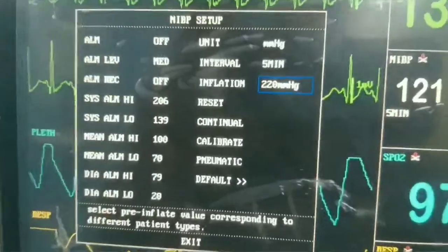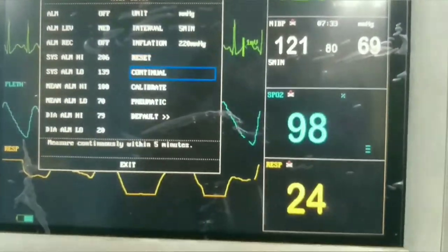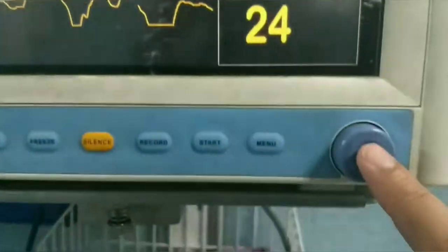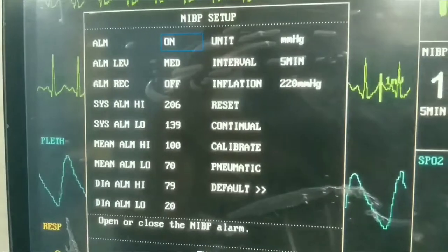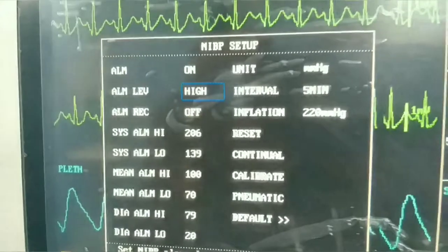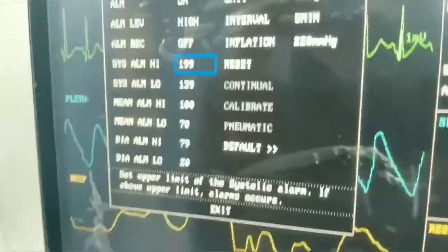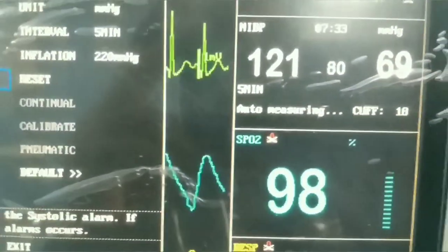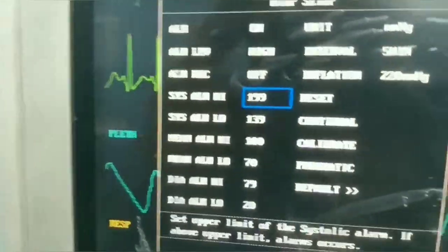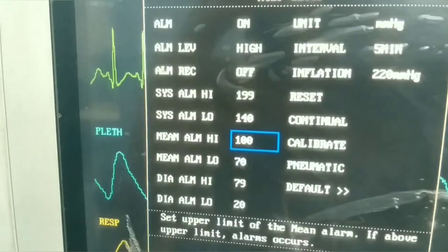In the NIBP — non-invasive blood pressure monitoring — setting, we use the knob to move the cursor up or down. We push in to engage the alarm setting and turn it on. We set the priority at a higher level. There are three settings: systolic, diastolic, and mean — each with a high and low alarm limit. When a limit is crossed, an alarm beep will sound.